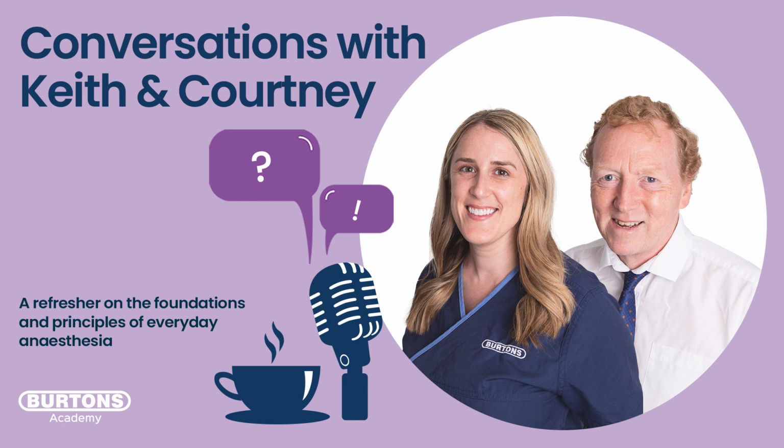It's a starting point. 2 things that we're going to consider. One is that we can always change it. And the other one is that we said earlier that we wanted to try and reduce that CO2 as the starting point for our ventilation. That will help us with overtaking the respiratory control.